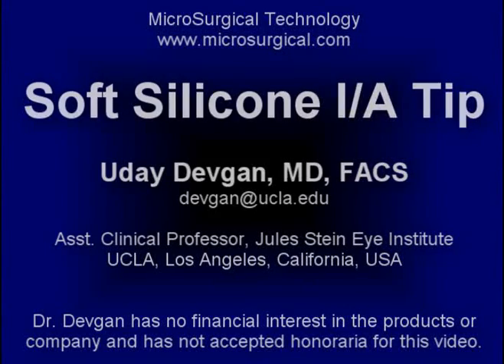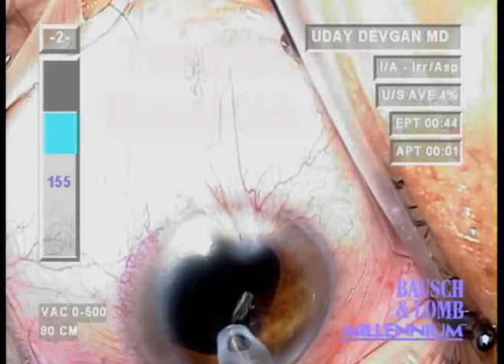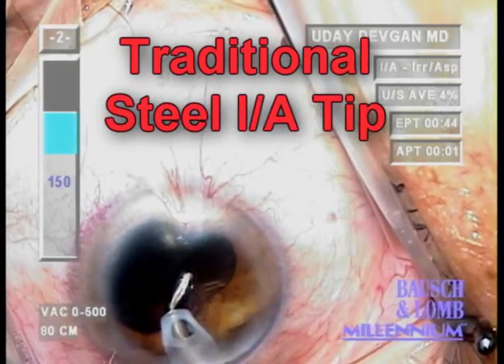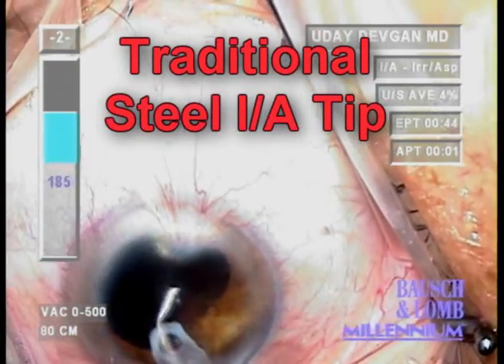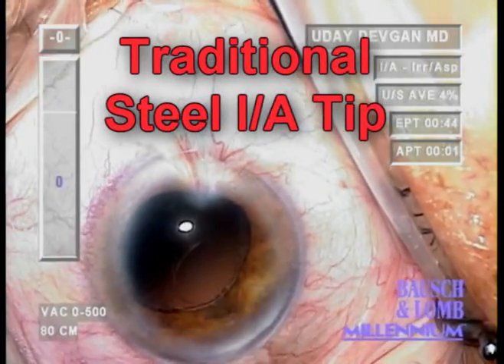Soft IA during cataract surgery using the soft IA silicon tip from MST. Using a traditional steel IA tip allows metal to contact the delicate posterior capsule and increases the risk of posterior capsule rupture, as we see here.